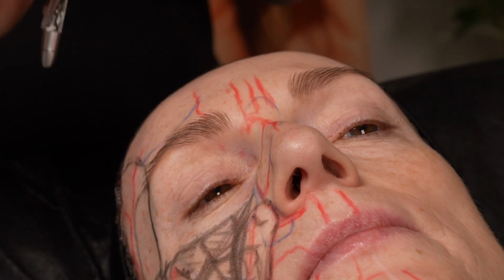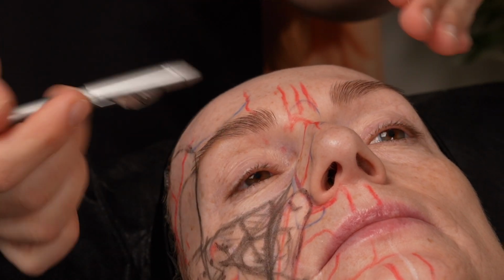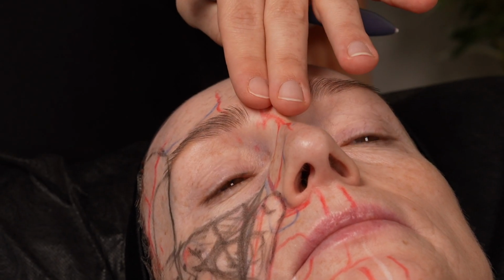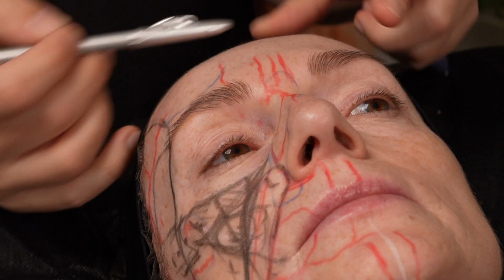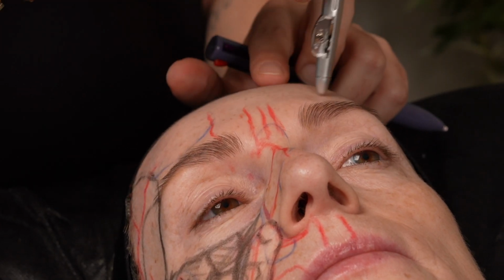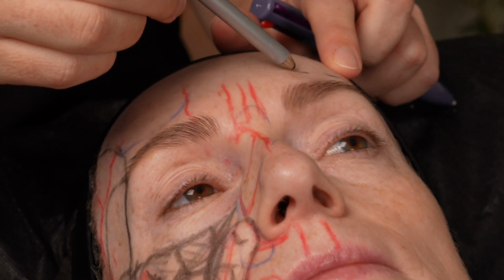Forehead, I told you, when you go up, it's getting more dangerous because of the internal carotid system. Nose is one of the most dangerous areas. And also the glabella has the highest blindness rate. The nose is the second. And for forehead injections, deep is safe, we can say it. We can inject with a needle. We can also use a cannula. Cannula is safer, of course. But there is also another safety line.